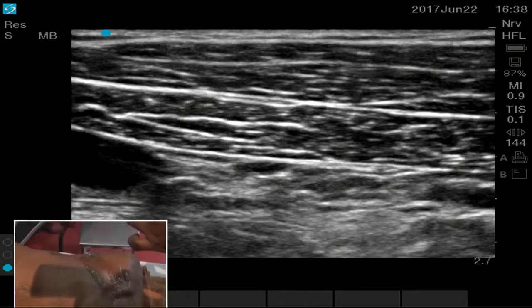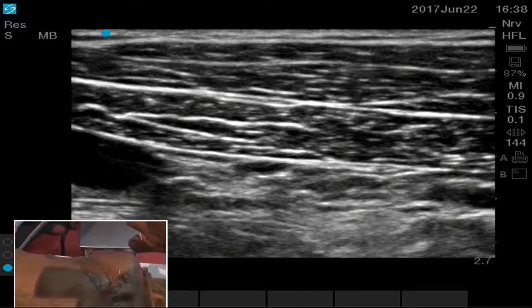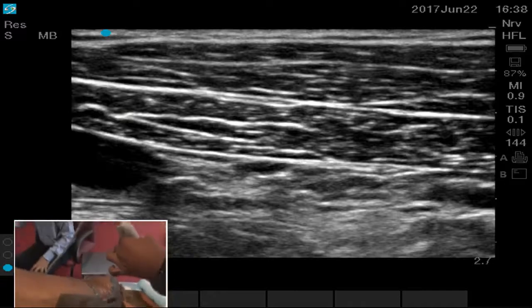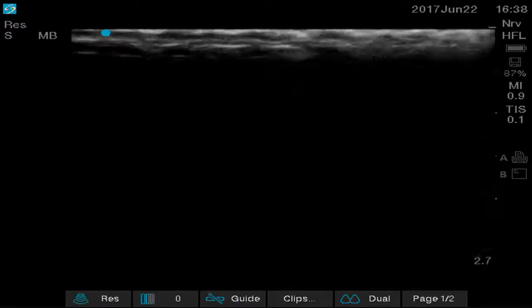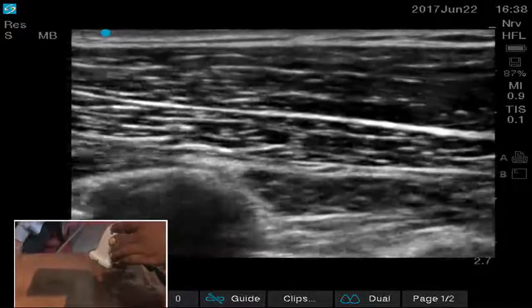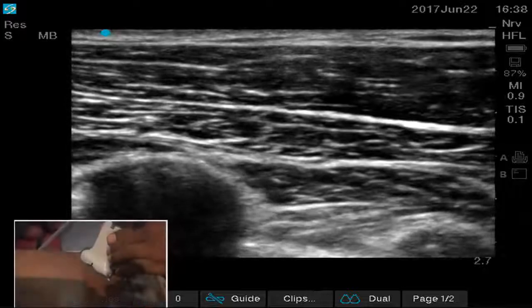These are all the pectoral nerves. So if you deposit the local anesthetic between the pec major and the pec minor, you will anesthetize the pectoral nerves. And pec 1 is between major and minor, whereas pec 2 is between pectoralis minor and the serratus anterior. I will show you and screen it. So now I am just scanning a little bit and then making the slightest medial inclination.